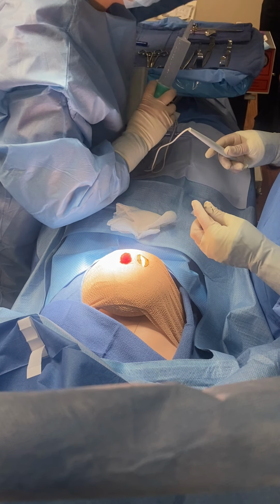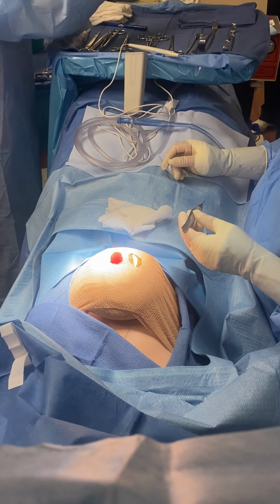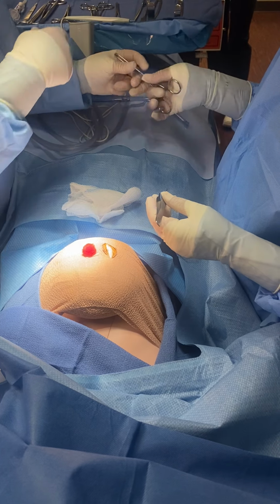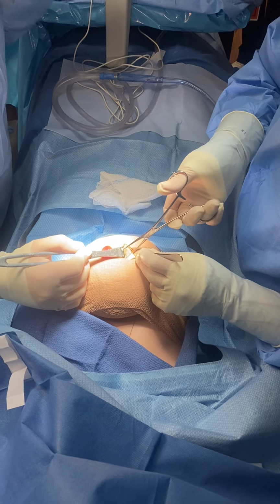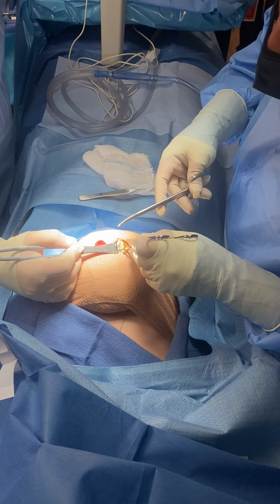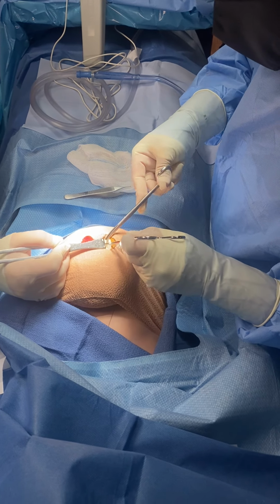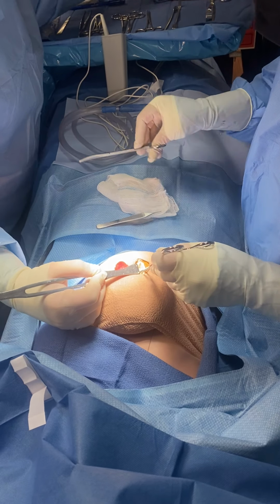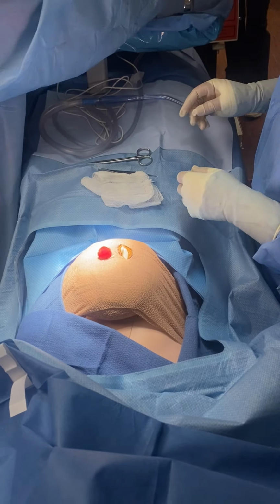Yes. All right. Did we hear anything back from pathology? I see some cells that are kind of close to the anterior margin. I think you might want to take a little bit more. Okay. All right, we're going in. Oh, I see. Maybe this will be enough. These scissors are chewing. Oh, I'm sorry. There we go. Nope, that's good. All right, let's send this little bit. Do you want to mark this, or no, we don't need to? I don't think we need to mark it.